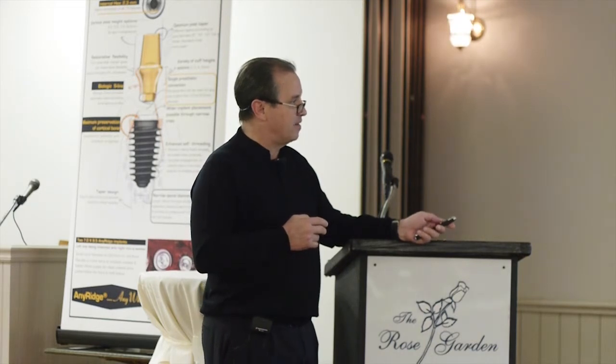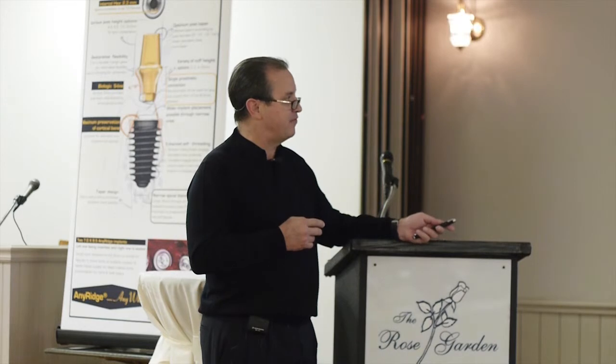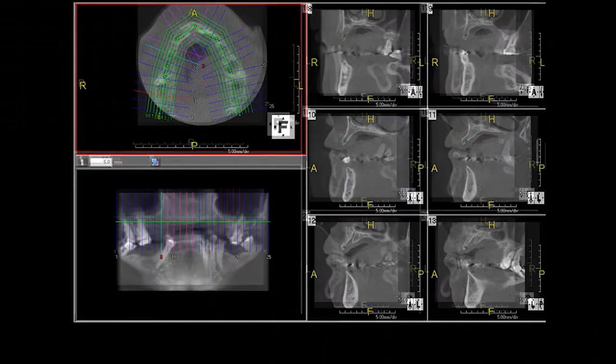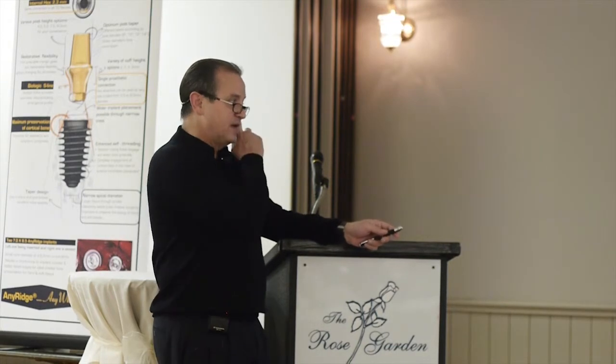This here, we're looking at the number 14 site. Get a good idea of how much bone height is available. Here we've done an antral elevation and immediate placement of the implant. A lot of years ago, it was like, well, we've got to augment this and then go back. These things grab that 3 or 4 millimeters of bone so well that rarely will we graft the site and then go back and do this later. We just do it at the same time.